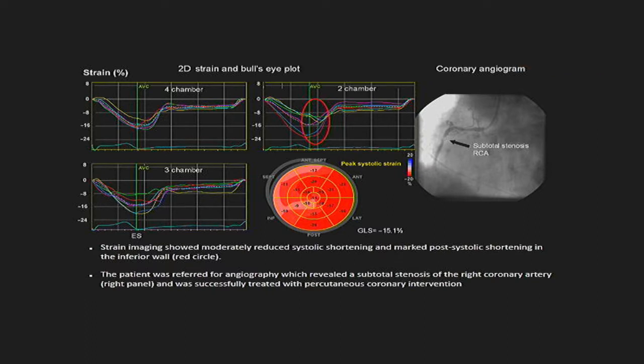And this is where it is very interesting. See, we have been using M-mode modalities in assessing the EF of the LV, but we all know that the ejection fraction is not a very comprehensive assessment of the LV function, and for the ejection fraction to become abnormal, it takes a lot of time, meaning when the LV is really diseased, that is when your ejection fraction becomes abnormal. So the usefulness of speckle tracking imaging or global longitudinal strain over EF is that it helps us in detecting subclinical abnormality in the LV function.